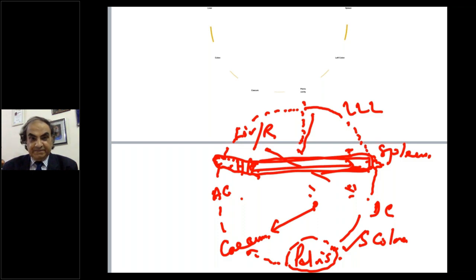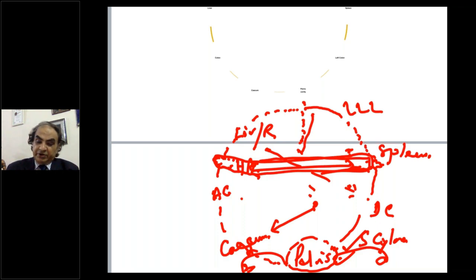Rectum can be seen. Pelvic organs in a lady, you can see the uterus and all the suspensory ligaments. Round ligament, you can see the infundibulopelvic ligament. They are all seen in laparoscopy very clearly. Now, when you are doing it, sometimes there is a problem in putting the small bowel back so that you are able to see it. This is what this clock method was, which you probably are not able to see clearly.